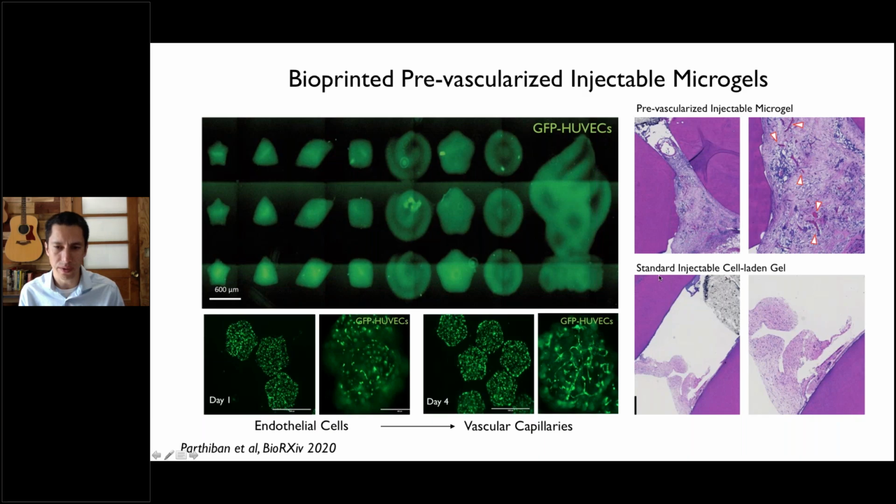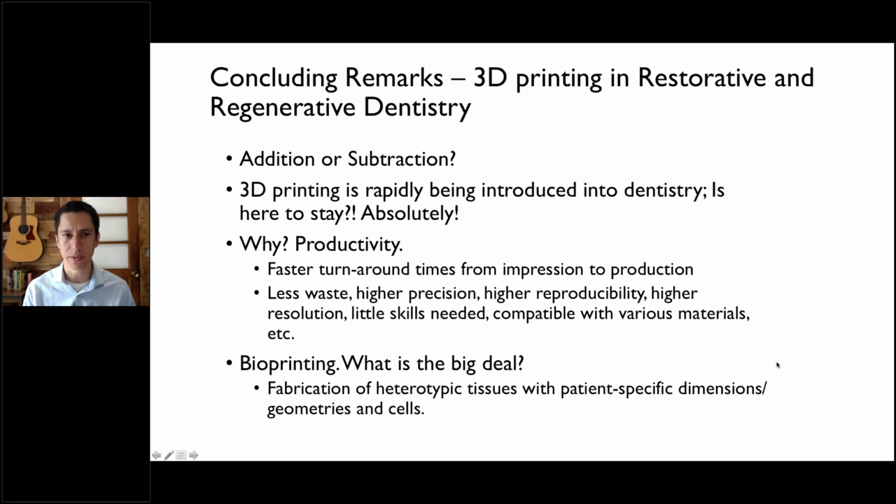Whereas if we compare with a standard injectable gel that you simply load into the root canal, there's a lot less tissue formation inside of the tooth. So this is just one example of what we've achieved with this printing process.